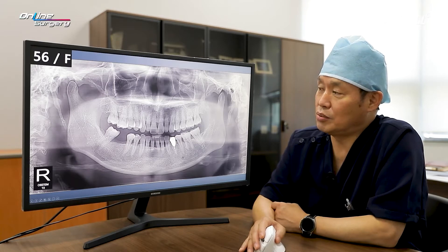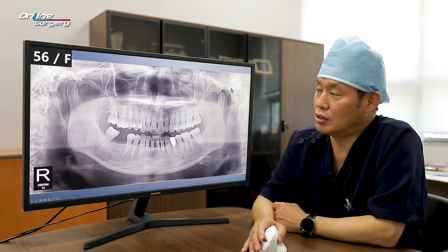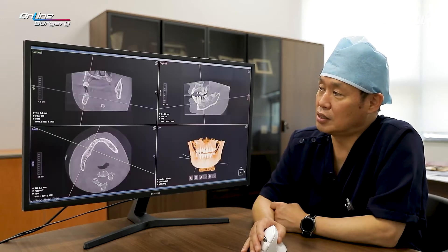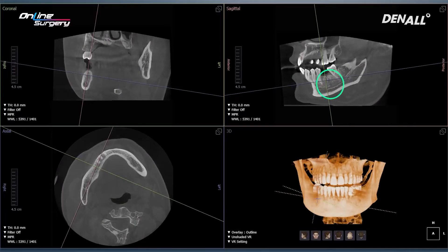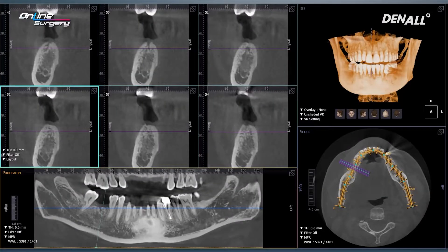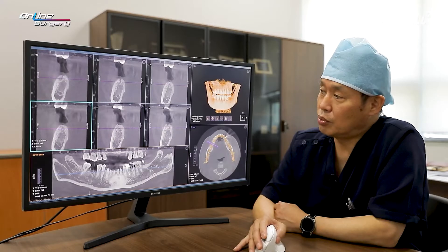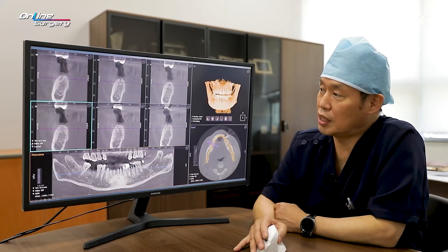However, the patient just wanted implant placement in the missing area and the treatment plan was formed accordingly. The distance with the inferior alveolar nerve is sufficient. In the alveolar bone, there's not a lot of resorption — it's favorable. On the CT, there's sufficient distance with the inferior alveolar nerve. The distal tooth is mesially tilted, and therefore there can be food impaction after prosthesis is delivered.